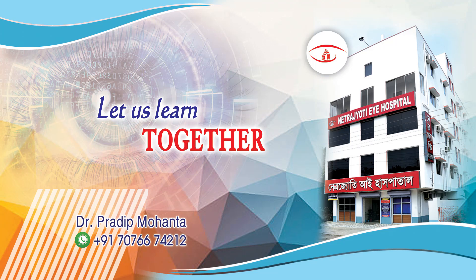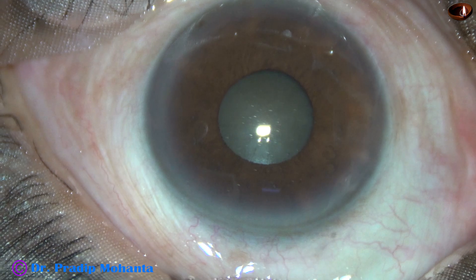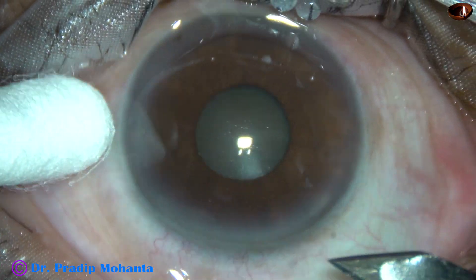Friends, welcome to my workplace at Ranaghat, West Bengal, India. This is a hard cataract with small pupil. The size of this pupil is about 3.5 mm. Let us observe this surgery.